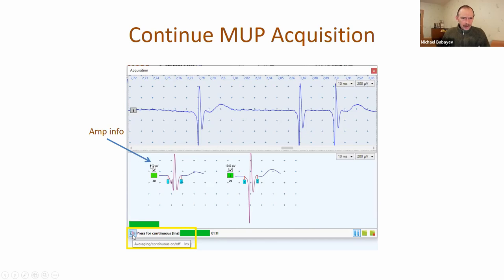Also, I would like to tell you that we added amplitude information values for motor unit potentials, because some laboratories would like to remove low amplitude potentials from the analysis at this stage.